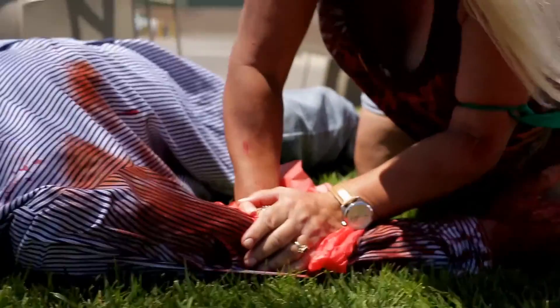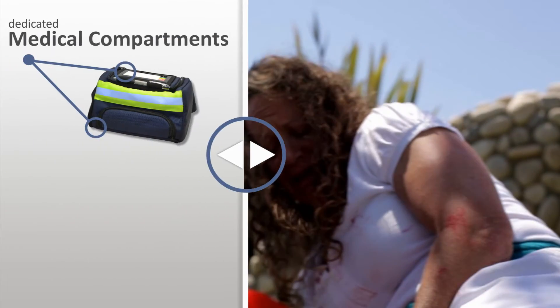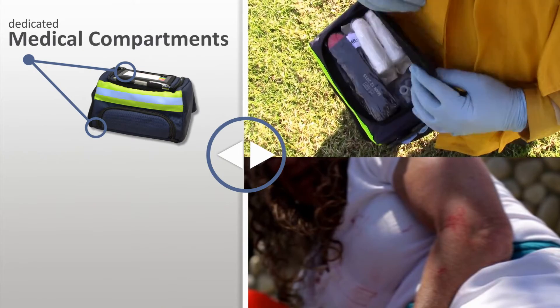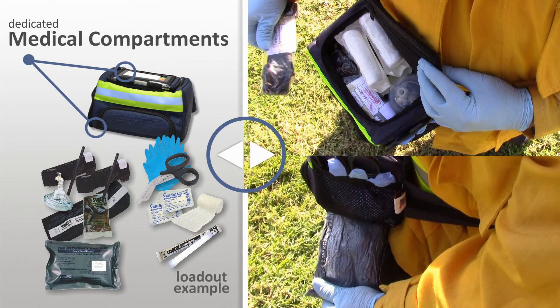Critical hemorrhage control and allowable airway supplies must be readily available and easy to access. The dispenser's dedicated upper compartment provides rapid access to these supplies when needed. Additional tourniquets or large dressings may be stowed below the ribbon bay. The storing of medical supplies separate from the ribbon compartment is a critical design consideration to ensure unobstructed and immediate access.